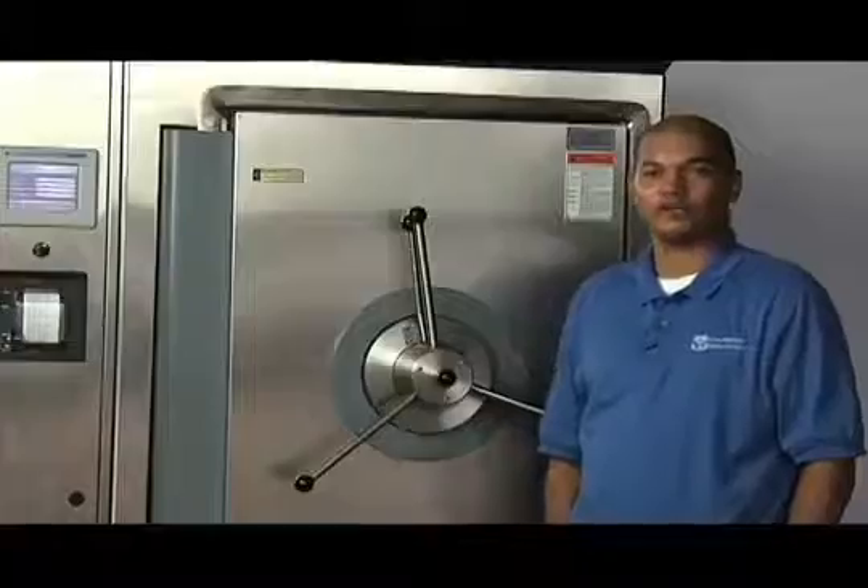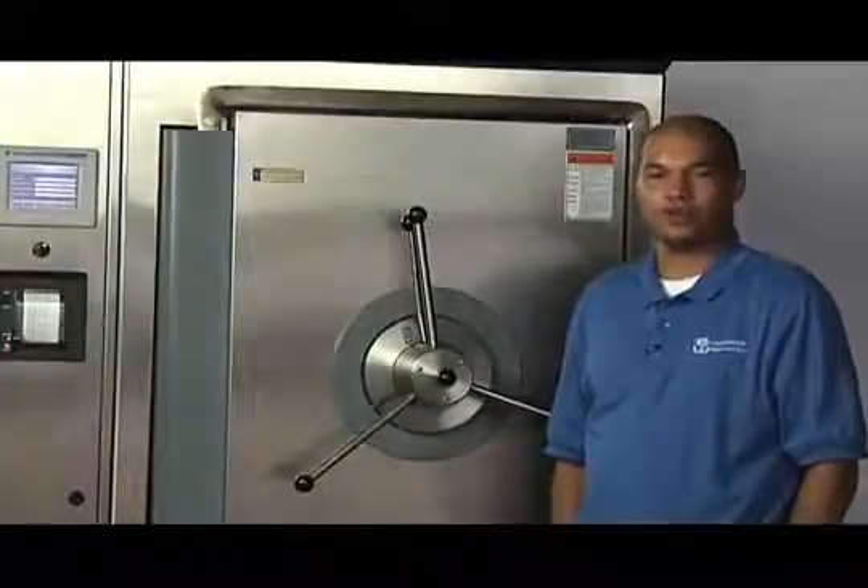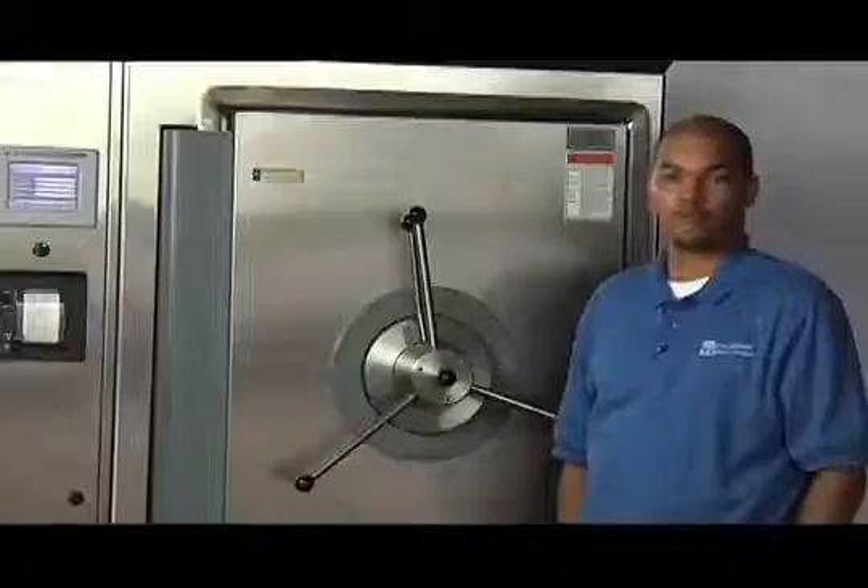Welcome to Consolidated Sterilizers instructional training video series. My name is Trevor Altman and in today's video we'll be showing you how to properly tighten the door on your 24 by 36 size sterilizer.